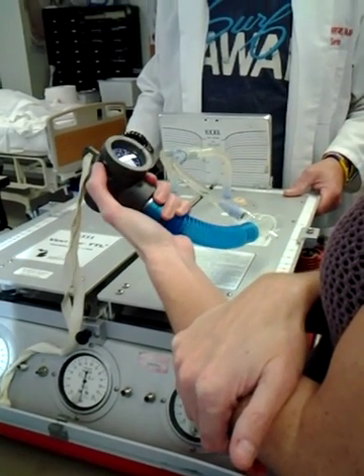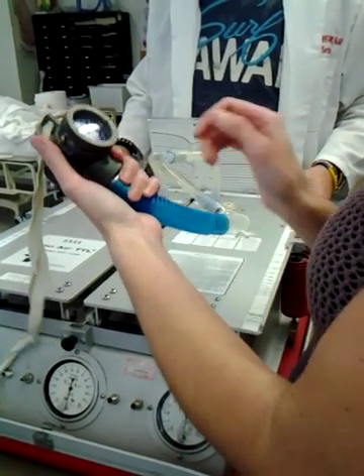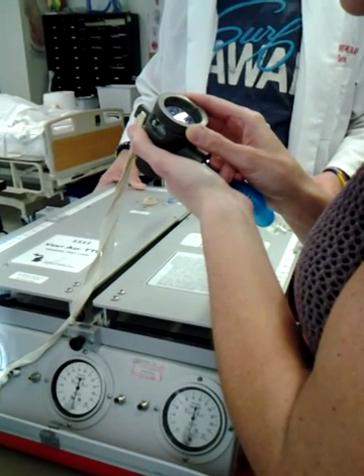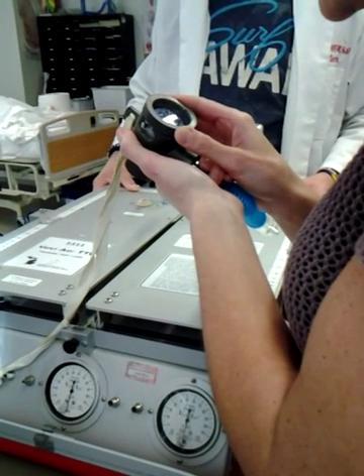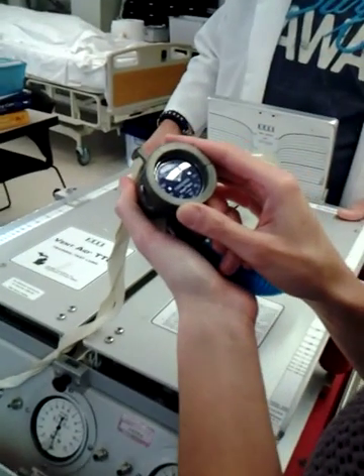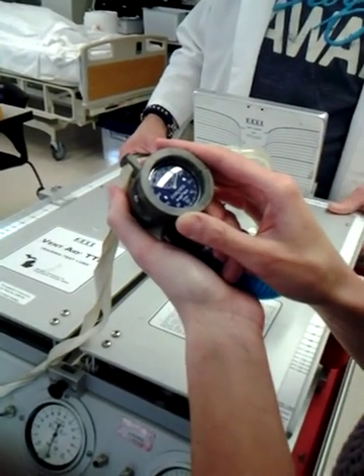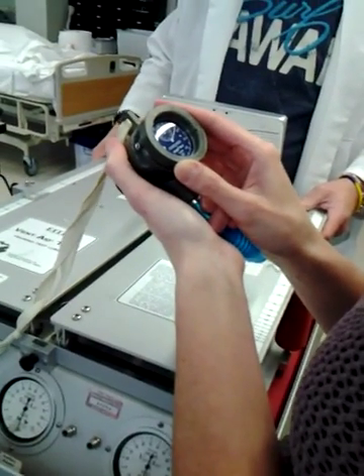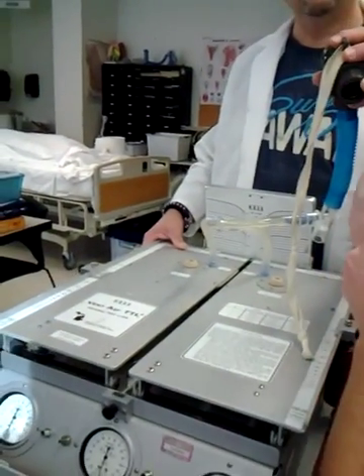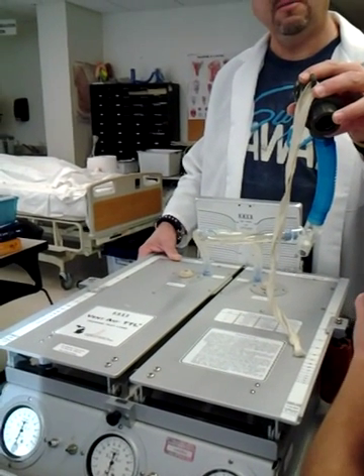Okay, so that was 28 breaths, and it is — hold on — seven point one six, seven, point one, six, seven.